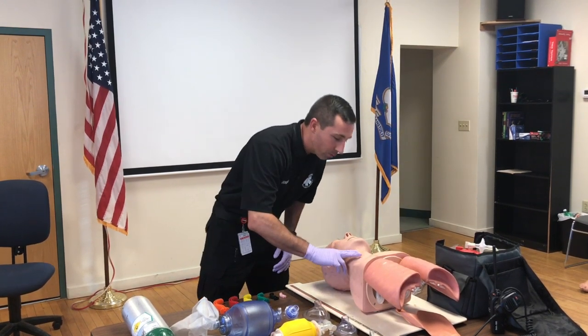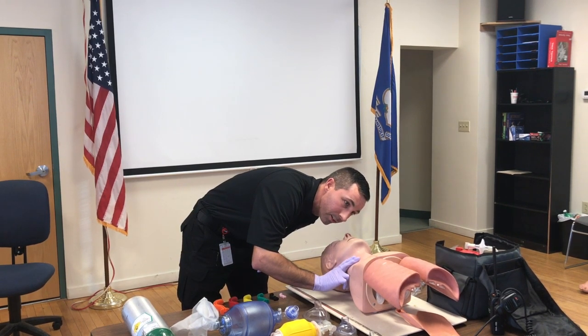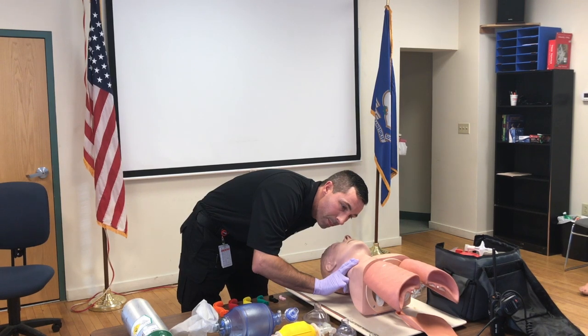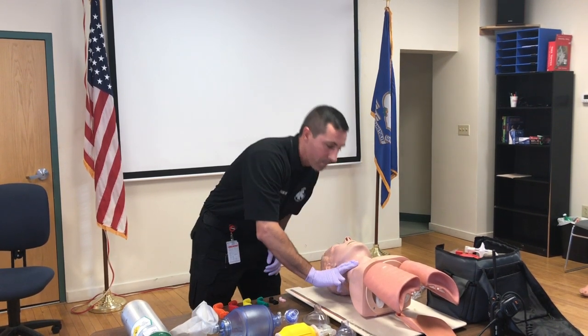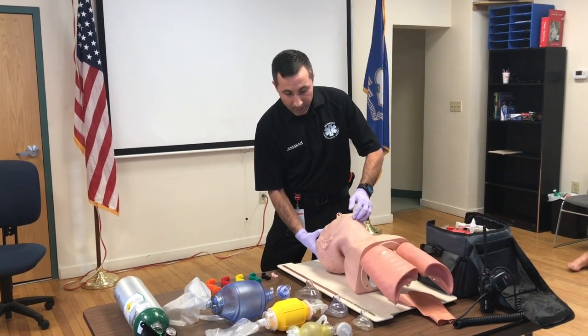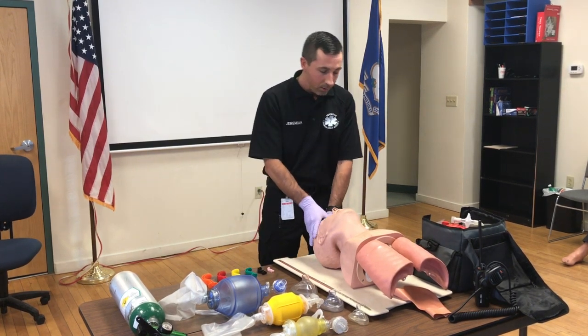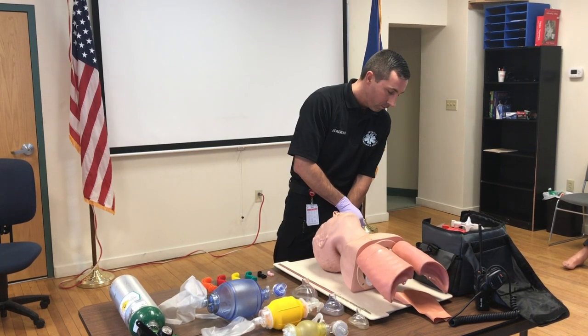Next, I'm going to come in and assess for pulse and respiratory rate simultaneously. Looking for pulse and breathing simultaneously. Your patient is unresponsive, apneic, and has a weak pulse of 60. Noted. Now we're going to open my patient's airway using a head tilt chin lift maneuver. At this point, what do I see? You notice the mouth is full of secretions and vomitus.